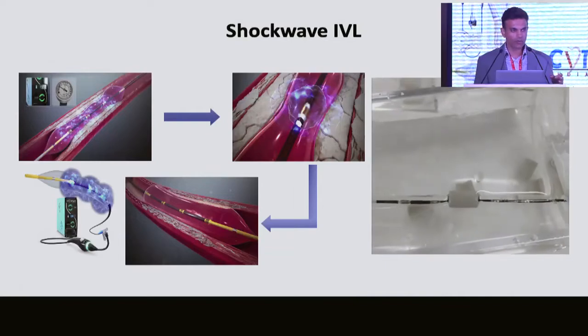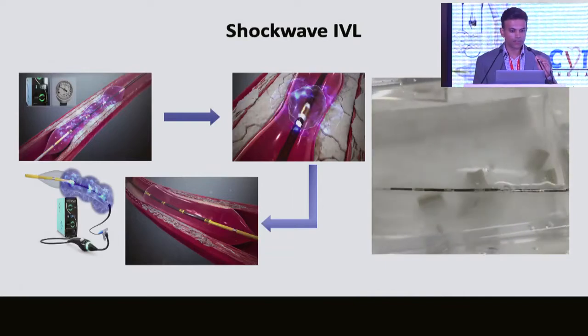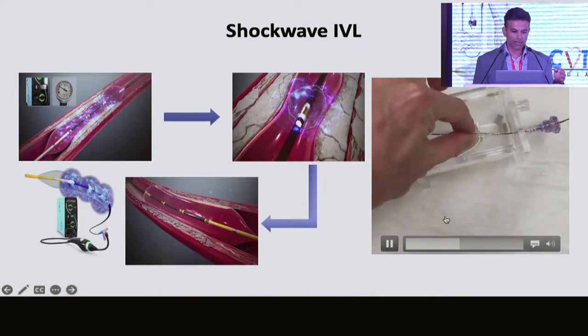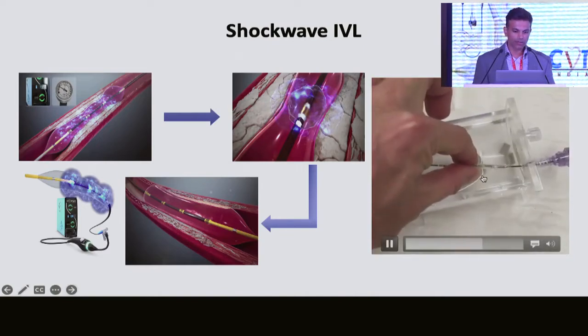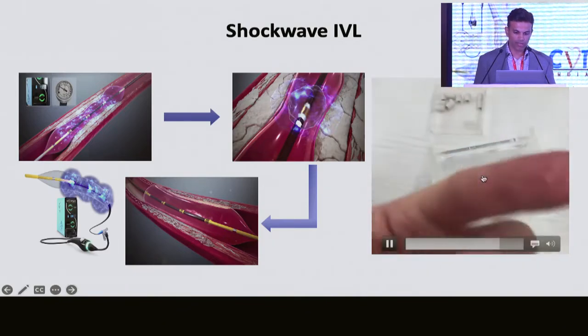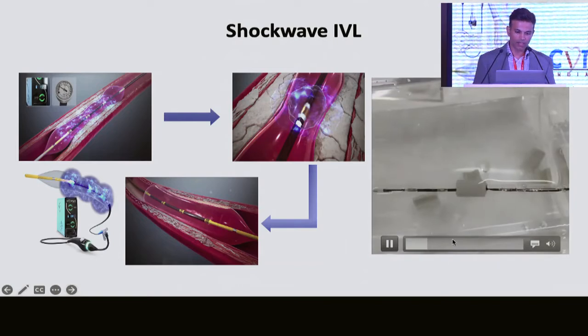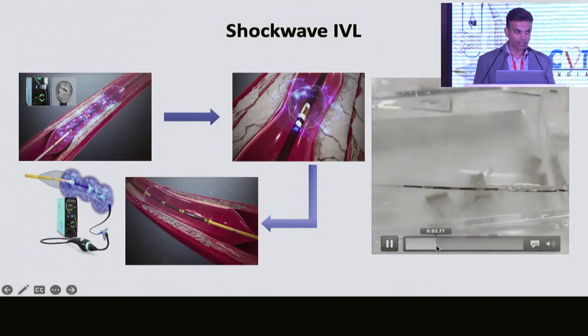What about Shockwave in my last couple of minutes here? Shockwave, this is a brilliant technology. This is my friend Lorenzo Azzolini. These are his fingers, right? So this is shocking his fingers, nothing happens, but then you shock the cement and it blows up in front of you very nicely, right?